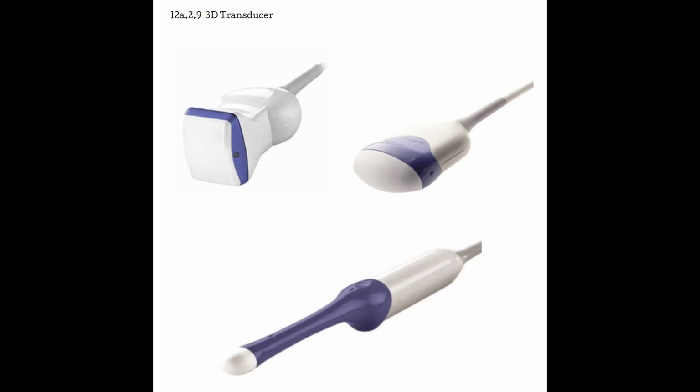They're going to have what looks like a checkerboard of elements at the front of the transducer. Most of our modern 3D transducers have anywhere from 2,000 to 9,000 elements at the face. Again, those elements are capable of getting information in all three planes all at one time. And if we were to be watching a 3D picture live, what we would consider to be in real time, that is the fourth dimension or 4D image.